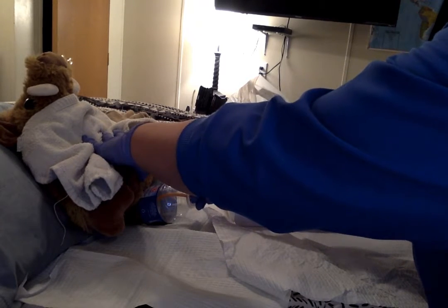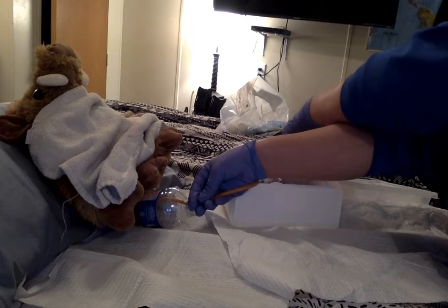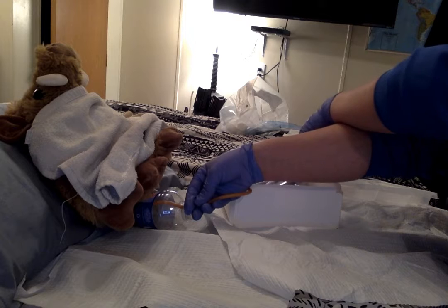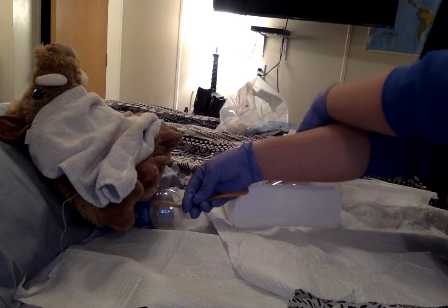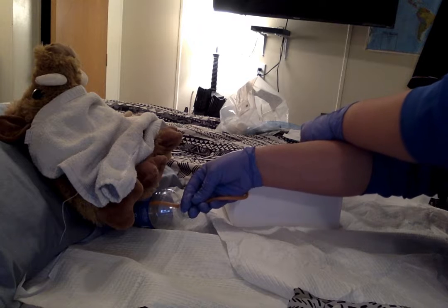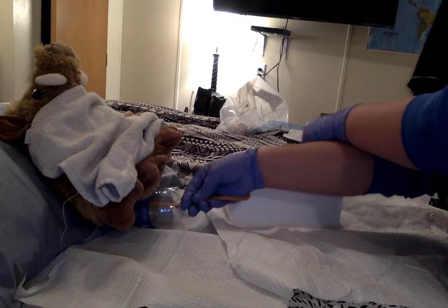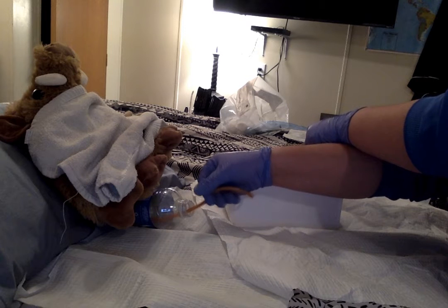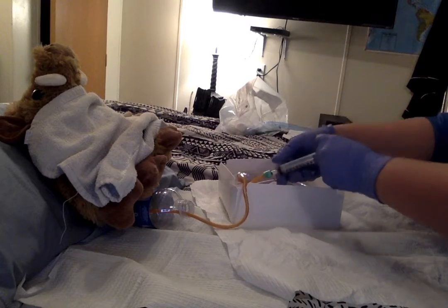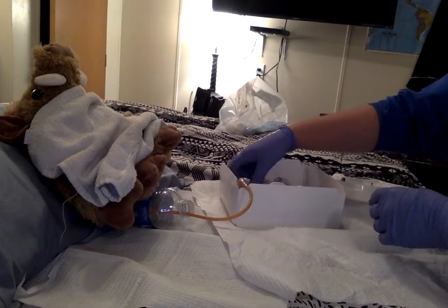I'm going to take my non-sterile hand, and I'm going to push in the fluid with the 10 cc's, and I'm going to make sure that I'm not contaminating my sterile urinary catheter. And then I'm going to pull back, make sure that that's in place. I'm going to push it back in. Now we are done inserting the catheter.